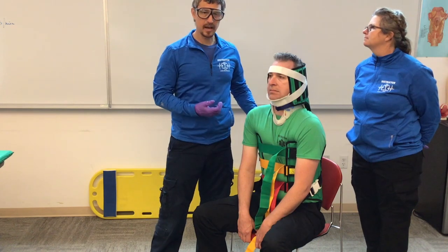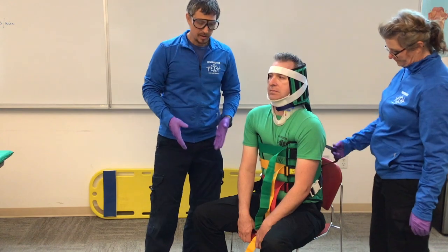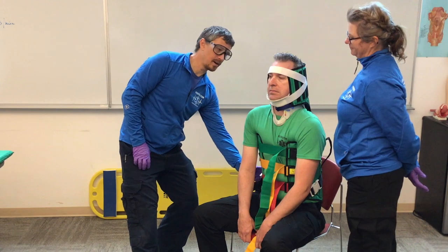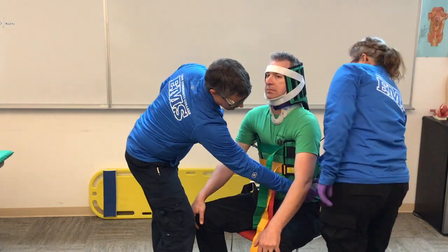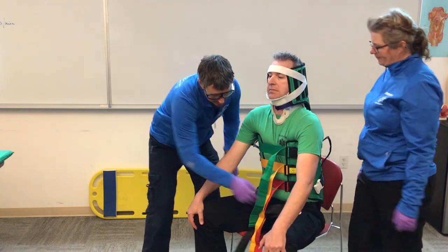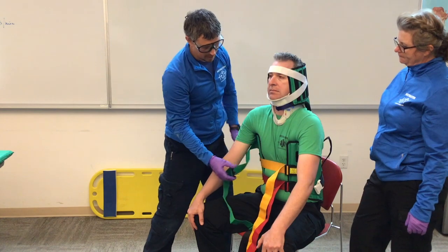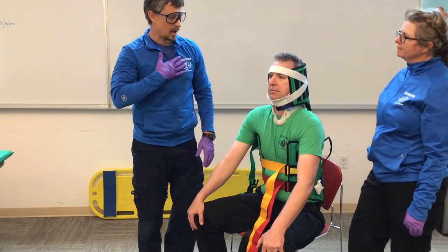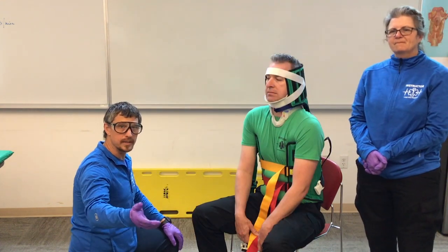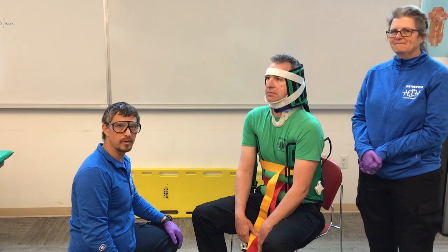Now we're going to lift Chandler and move him to the backboard. Once he's on the backboard, the leg straps will hold his legs up — kind of like a dead cockroach — so we need to release the leg straps to allow his legs to lay flat. We also release the top strap so we don't impede the rise and fall of his chest when he breathes. Then we transport the patient. That is the seated backboard, or KED.